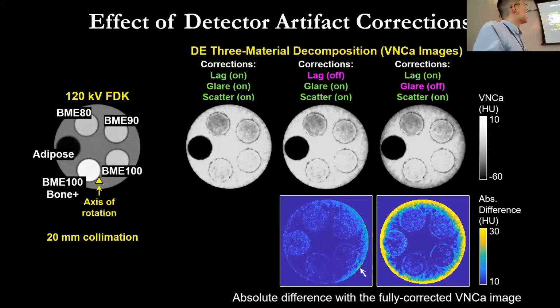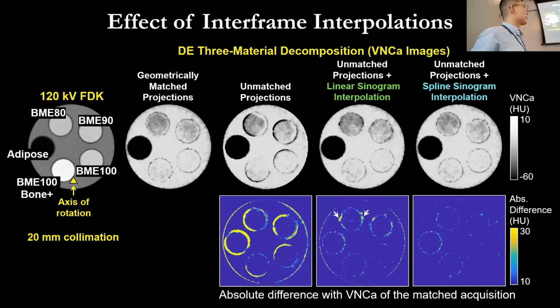Okay. Because I think it's reduced most of the artifacts. Yeah, I'm just trying to reconfirm what you said, whether I understood. Yeah, that's what I'm thinking about. I mean, we're definitely going to try some larger phantom with a more complex structure that is not like a circular insert, right? Because it depends on many things. For example, if you have more complex bone structures, it might not be that accurate, or if you have a very poor signal. There are also many other reasons. Thanks.